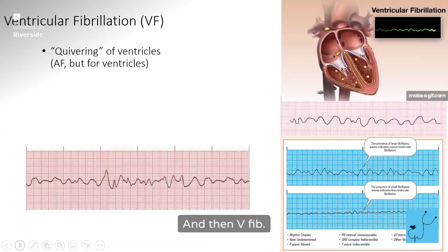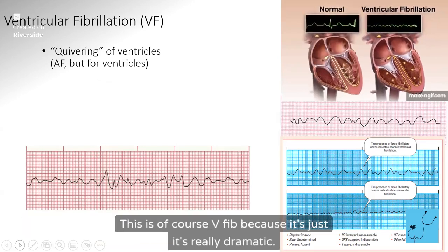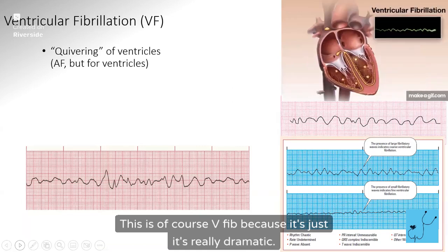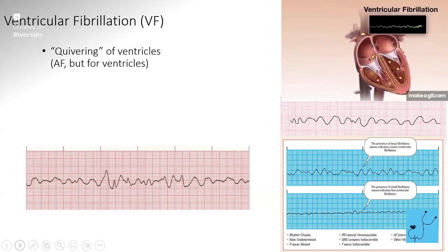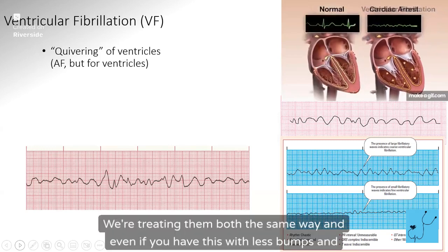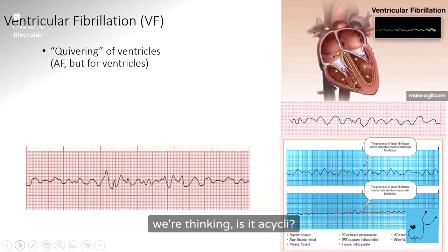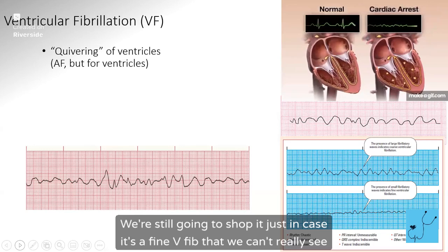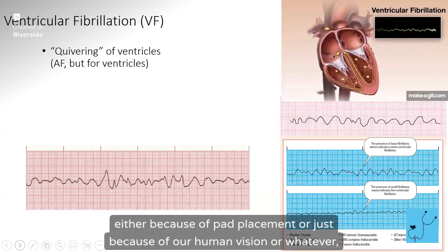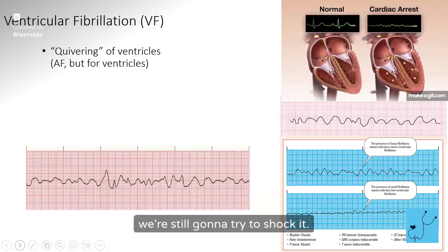And then VFib. The VFib looks several different ways. This is a coarse VFib because it's really dramatic. This is more of a fine VFib because it's kind of small and subtle. We're treating them both the same way. And even if you have this with less bumps and we're thinking, oh, is it asystole? Is it VFib? We're still going to shock it just in case it's a fine VFib that we can't really see very well, either because of pad placement or just because of our human vision. We're still going to try to shock it.